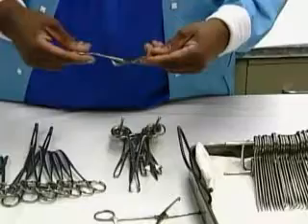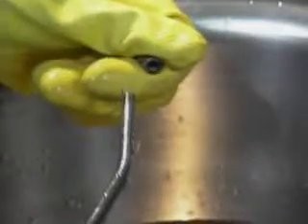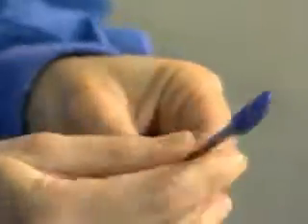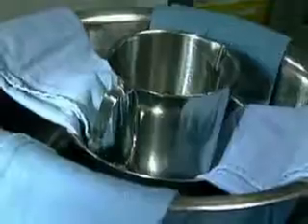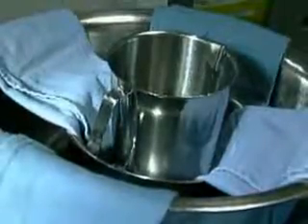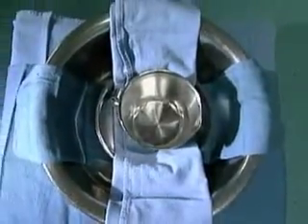All instrument joints and hinges must be opened to ensure contact with the sterilizing agent. All instruments with detachable parts must be disassembled. Heavier instruments are placed on the bottom so they do not damage delicate instruments. Tip protectors made of permeable material can be used on sharp instruments. An absorbent towel or other porous material must separate items such as basins and medicine cups that are nested. This allows for steam contact with all surfaces.